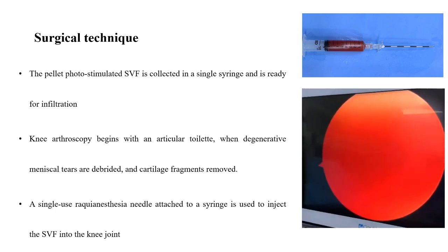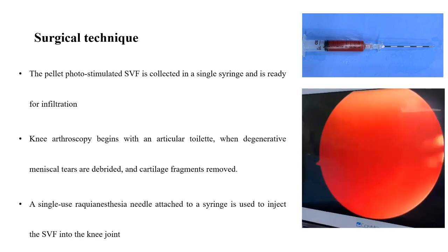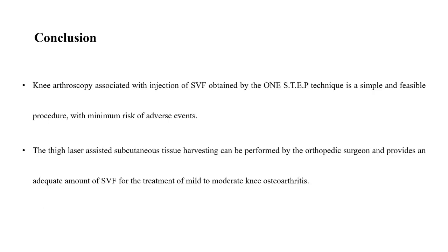Arthroscopy begins with an articular toilette where degenerative meniscal tears are debrided and cartilage fragments removed. A single-use needle attached to a syringe is used to inject the SVF into the knee joint.